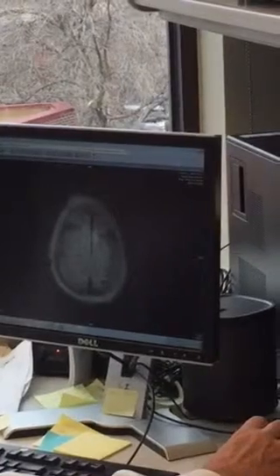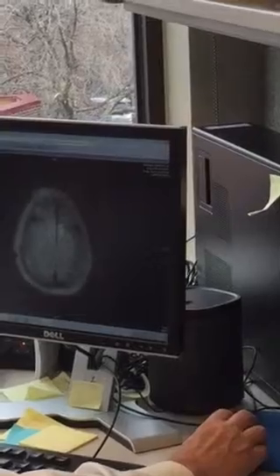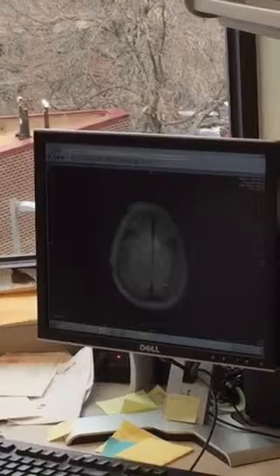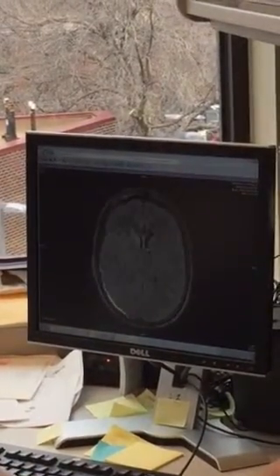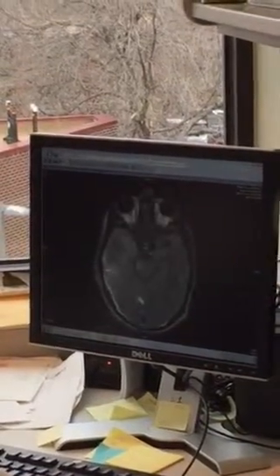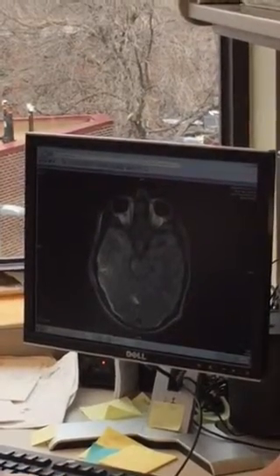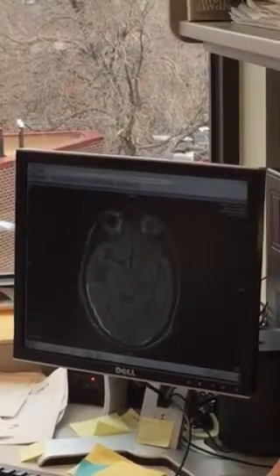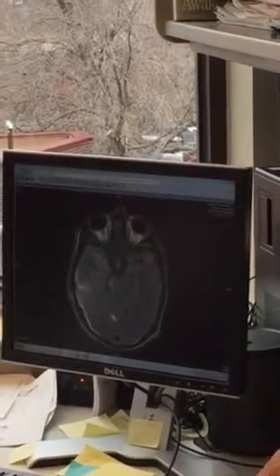Looks like you've got something right there on the very top. Now your eyes are going to be here, and this is going to be on the left side, right about here. And you got some blood in here. No biggie.